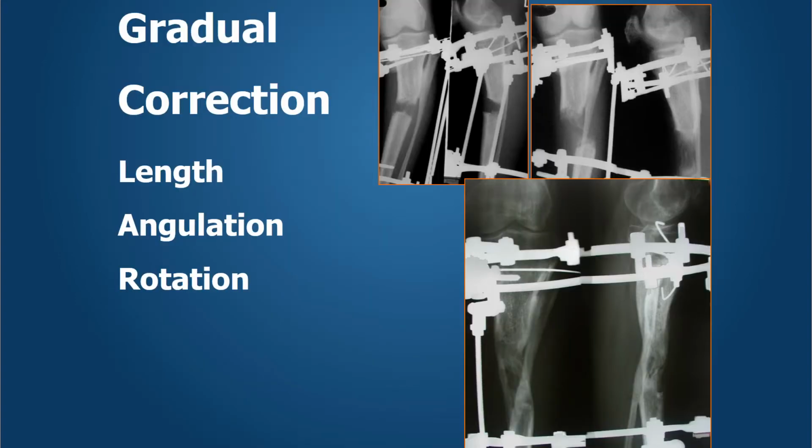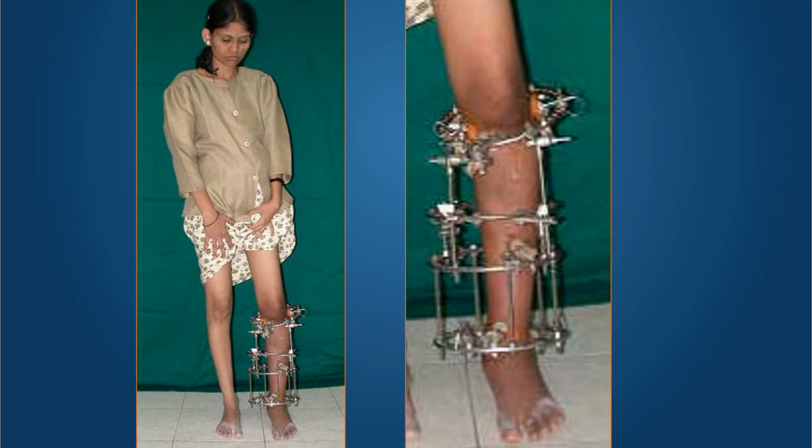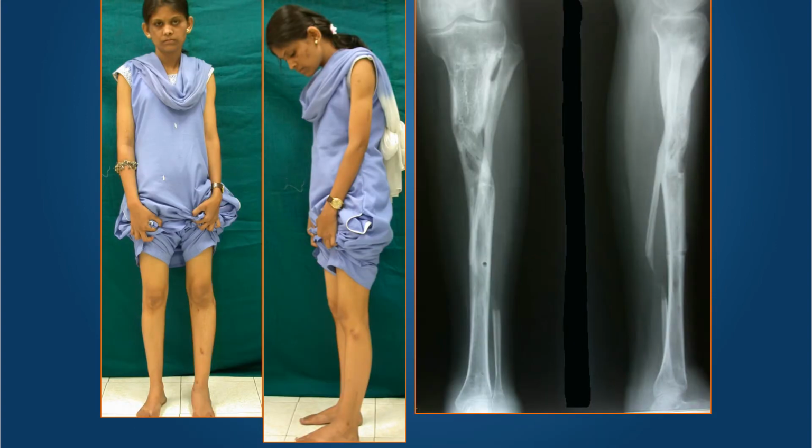So we used the Ilizarov fixator in the mode which allowed us to achieve length gradually with angular correction of the oblique plane. And then once the lengthening was achieved and the angular correction was completely done and the rings became parallel to each other, we were able to put in a derotation assembly between the two parallel rings, as you can see in this picture, to achieve an outward rotation of the distal fragment to get this very accurate correction. Equal leg lengths in this lady, with complete correction of the varus recurvatum and internal rotation deformities as well as shortening.